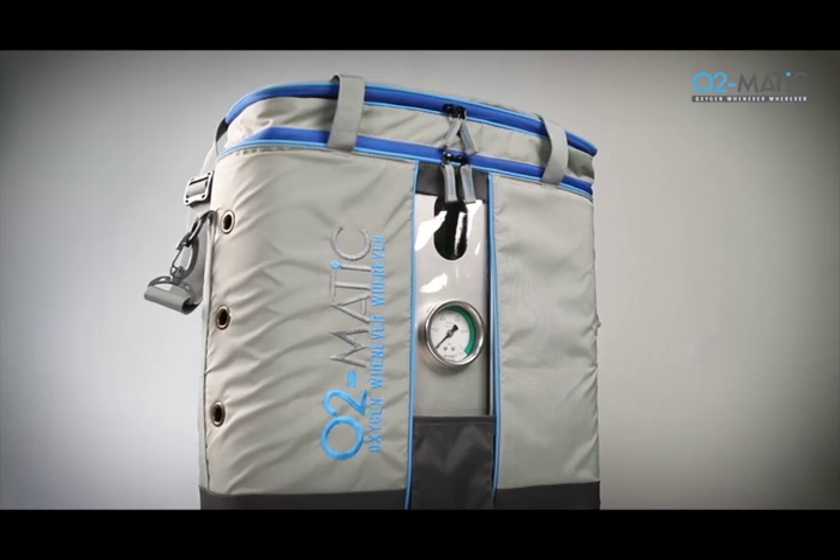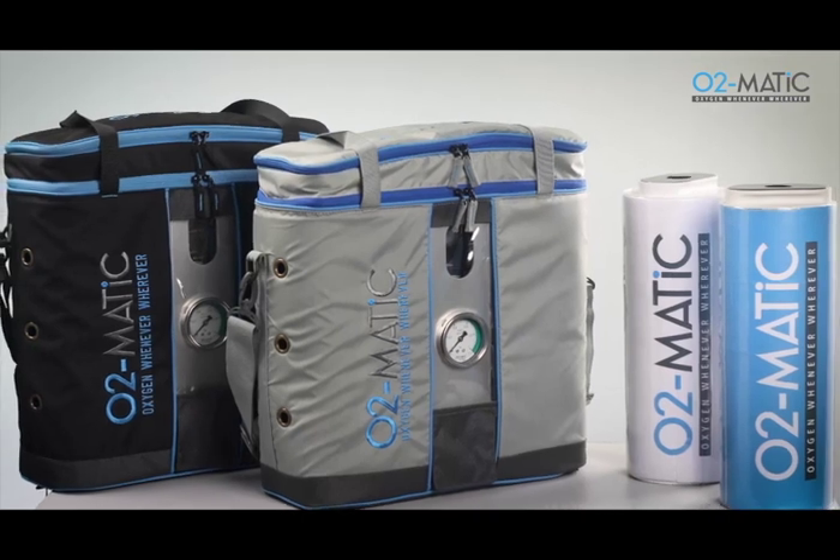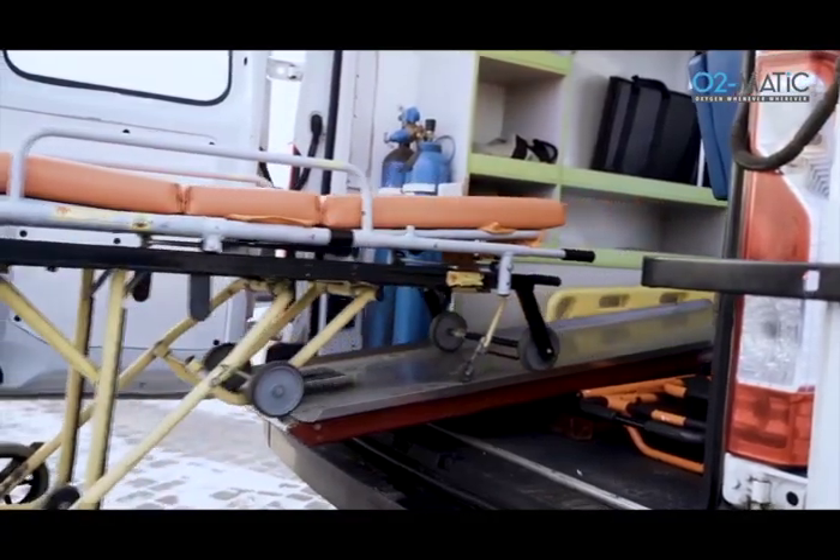With world-class design, tried and tested performance and unbeatable advantages, O2Matic is the go-to device you require to meet any medical emergency, whenever, wherever.